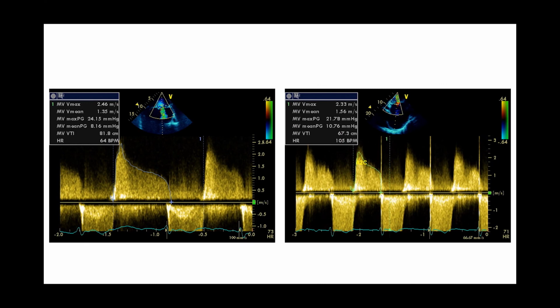So to conclude, so what's the summary? Yeah, conclude that we're seeing a mitral stenosis from a grading point of view that would probably be more likely in the severe category. We haven't seen any pulmonary pressure, so upstream effects we haven't examined with a massively dilated left atrium.